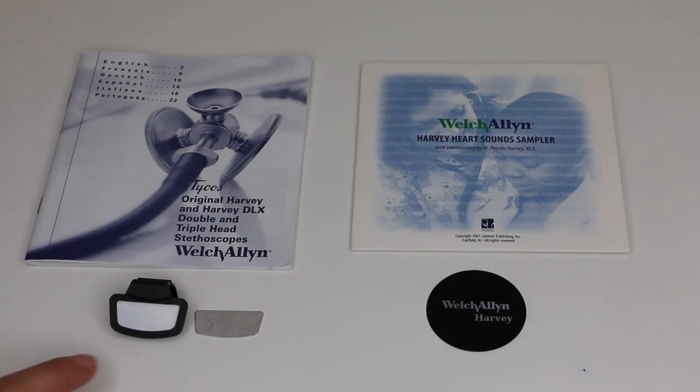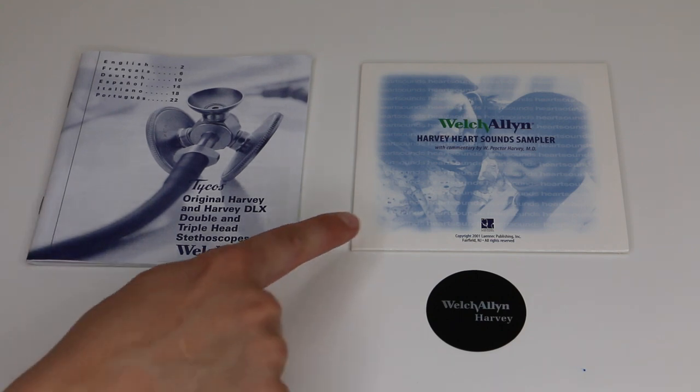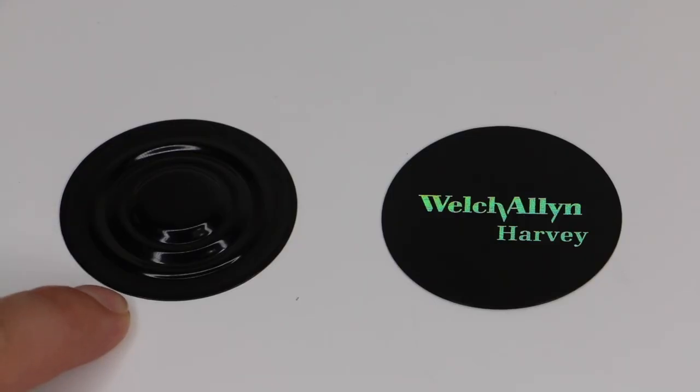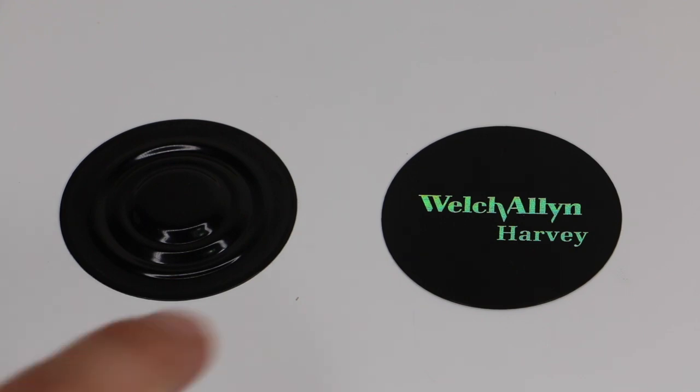Spare kit. In the spare kit you will get a name tag, a user manual, a CD that has got heart sounds on it so you can practice listening to heart sounds, and you will also get a spare flat diaphragm that replaces the corrugated diaphragm. The corrugated diaphragm is better for low frequency sounds and the flat one is better for high frequency sounds. I've given it a two and a half out of five.